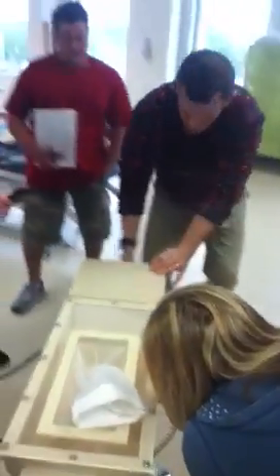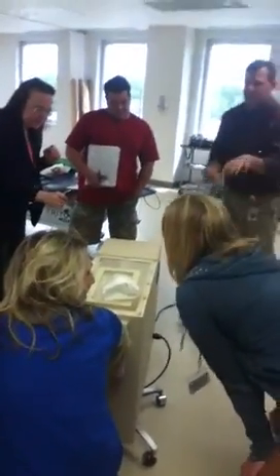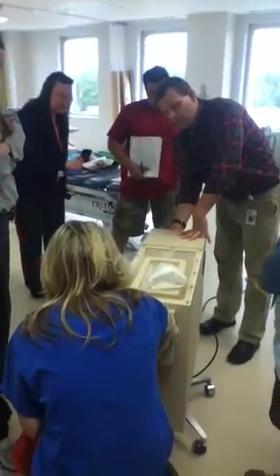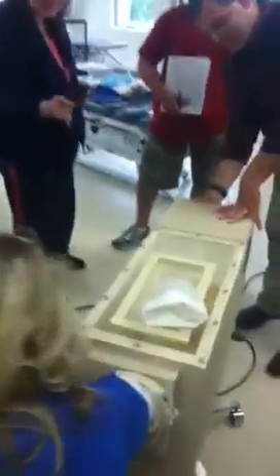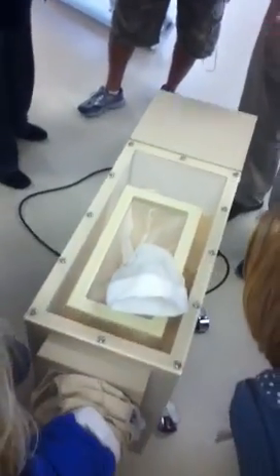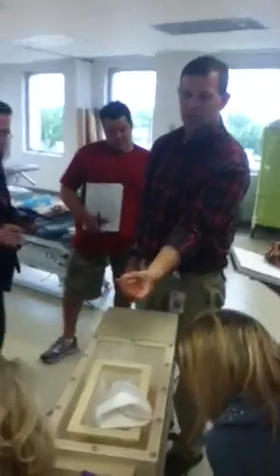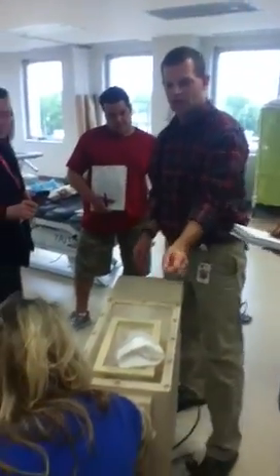It's sorting out. What it's doing is it's blowing that stuff up — it's more like having your hand in water than something thick. It's more of a liquid-feeling medium when it's actually working. I like it! It feels like water. It's amazing.